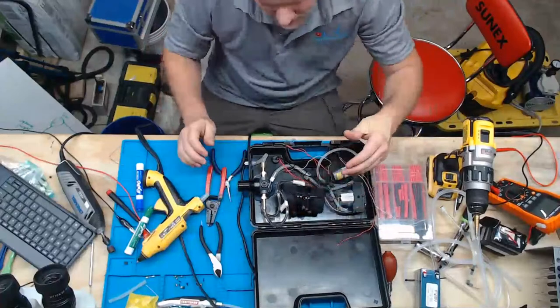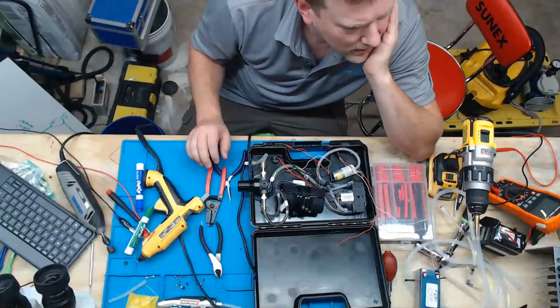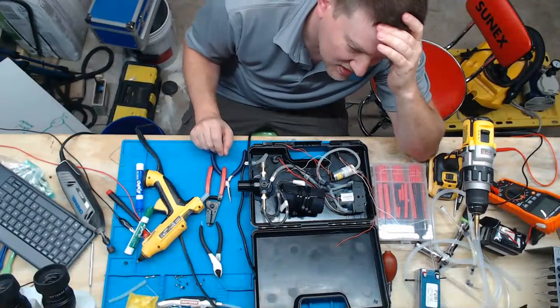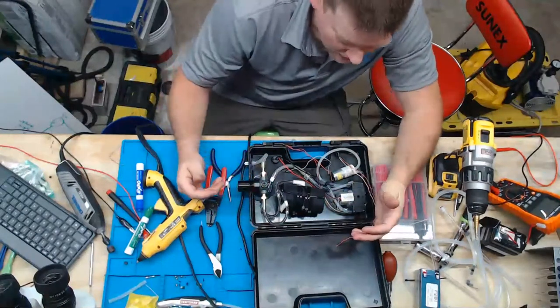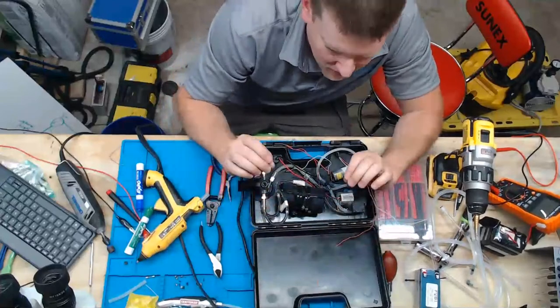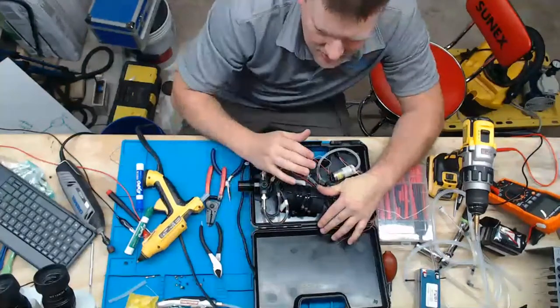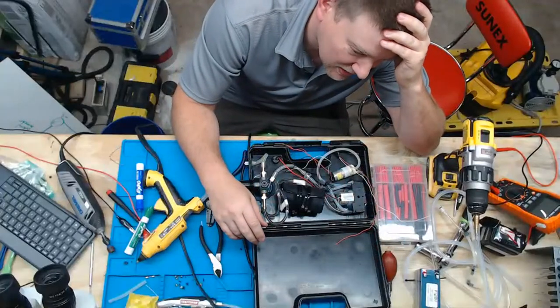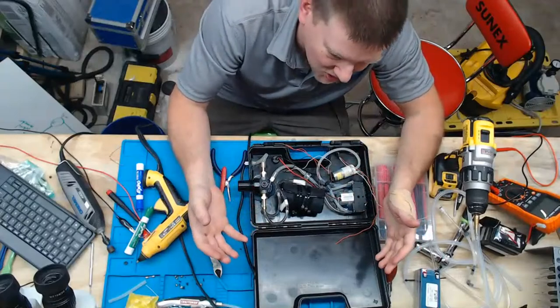Okay. So I actually got this idea because the kit that, is it Stryker? Anyway, the pneumatic tourniquets that we have, they will sell you a German-made regulator, and it connects a regular airline to your hospital air, and you have to assemble the kit, which is a pain in the butt. But they charge you like $800 for this calibration kit. And the whole time I'm thinking, why the hell are we spending $800?